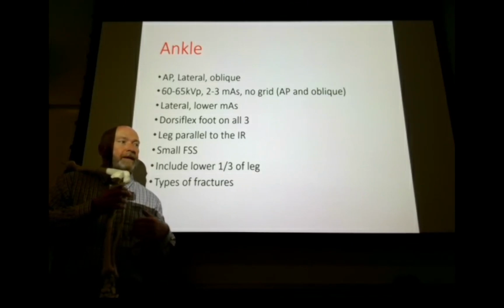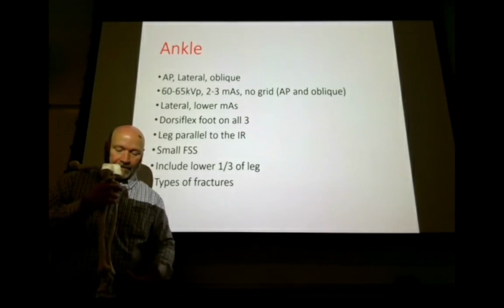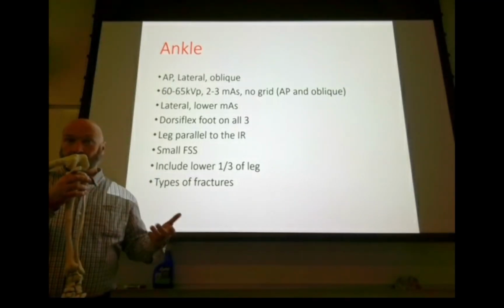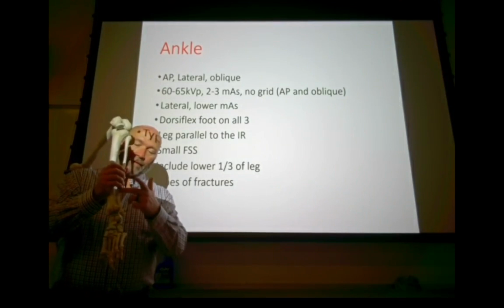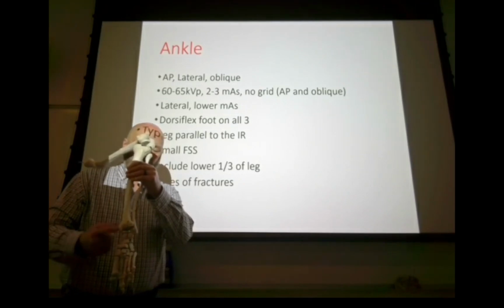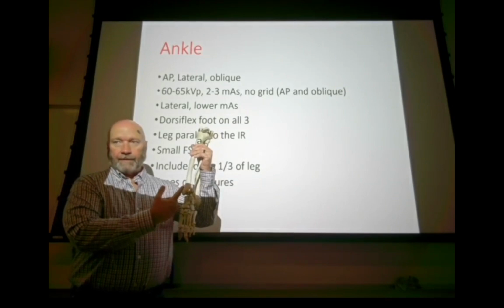Okay, so then your ankle becomes very unstable, and they can't just put a screw in it and fix it. So what they'll have to do then, and this is the most common orientation that I saw working in surgery, is they'll put a plate and screws on the lateral, on the fibula, and then on the tibia. If you've just broken off that medial malleolus, they'll just put a screw up into it.